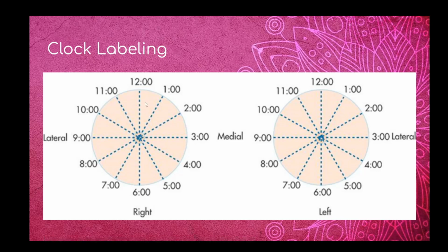As we move through the breast, we are going to follow these clock lines out. When we follow the clock lines out, we're scanning in a radial plane. Radial kind of means the radius of the circle. So we're following around those wagon wheels to image the entire breast. When we turn 90 degrees to any one of these lines, then we are anti-radial. And we'll talk a little bit more about that in a second.